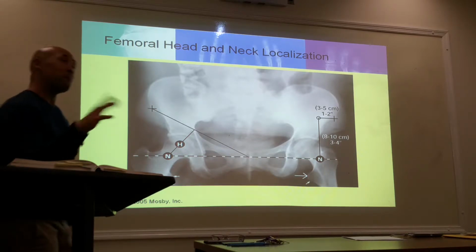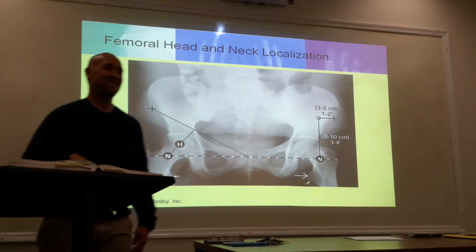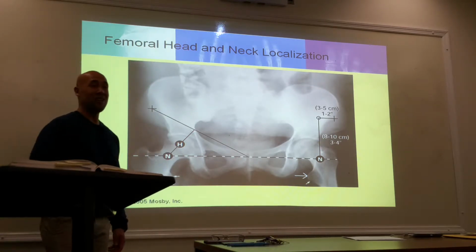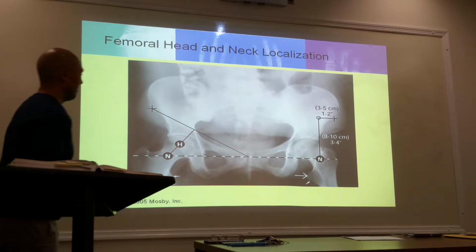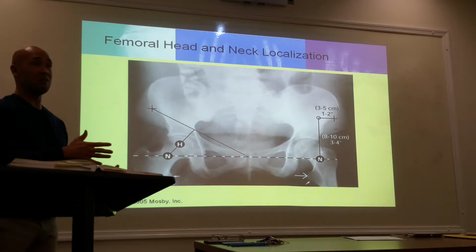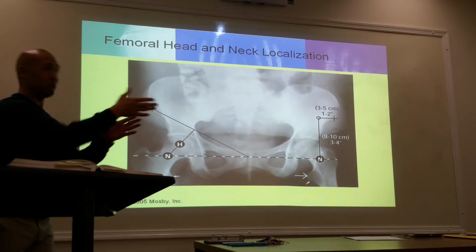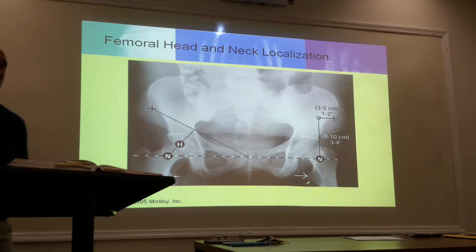And I can also do that, but what if there was a fracture on that side? Yeah, you can't wiggle their leg because now you're doing crunch, crunch, crunch, right? But you can do that on the opposite unaffected leg to find the level and then kind of draw that imaginary line from one side to the other and then connect the dots. You can do it that way.